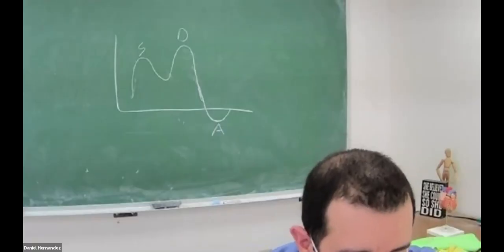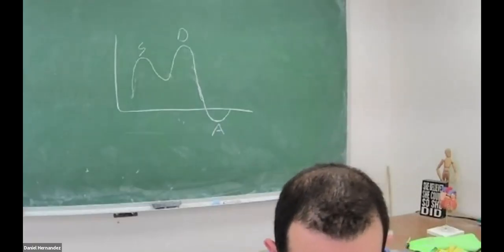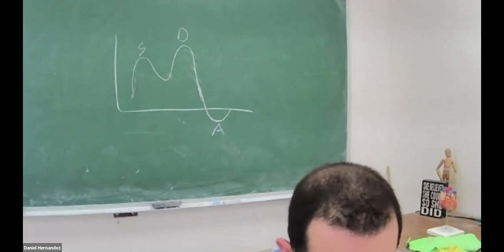I feel like I'd guess the wall motion one, but I don't know. I would agree with you. Let's see, 122. Yes, wall motion abnormalities associated with obstruction of the right coronary artery territory.